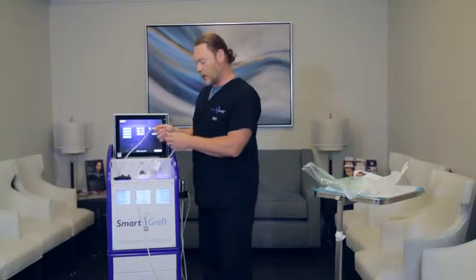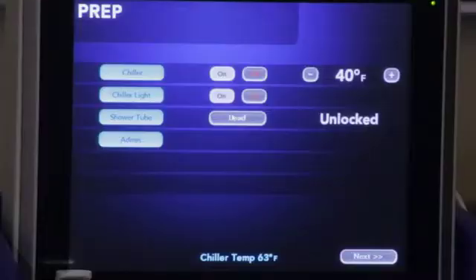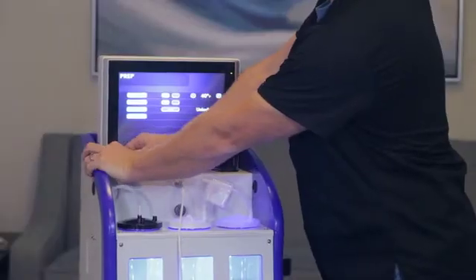Now to load this correctly, on this first screen it says shower tube. You want to hit load where it goes to unlock, and you just want to push this tube in until it clicks.